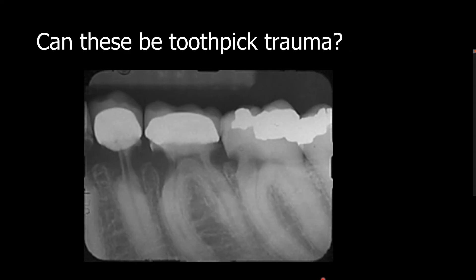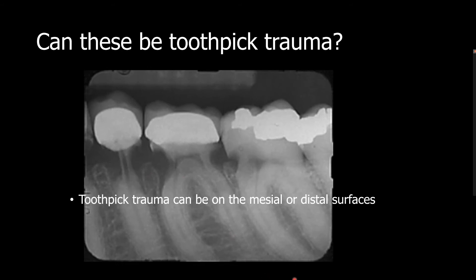Can these tooth structure losses be from toothpick trauma? Toothpick trauma can be on the mesial and distal. However, toothpick trauma will also damage the alveolar crest. The tooth is much harder than the alveolar bone, so it is not possible that the toothpick will only damage the tooth and spare the bone.